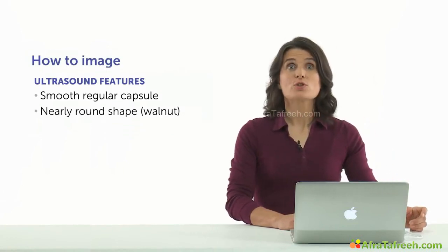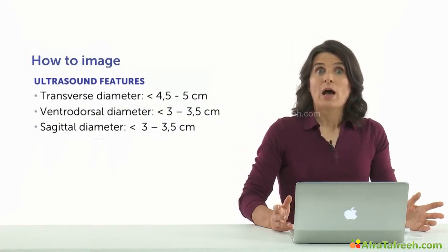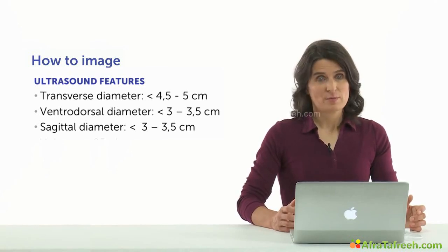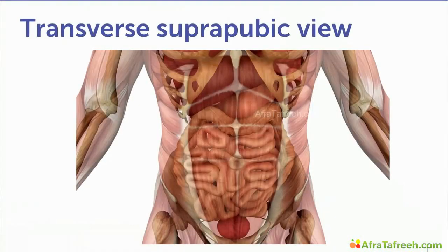The prostate should show a smooth regular capsule and a nearly round shape. It should have a volume under 25 or up to 25 milliliters, and the transverse diameter should be less than 5 centimeters. The longitudinal diameter and the ventral dorsal diameter under 3 centimeters.